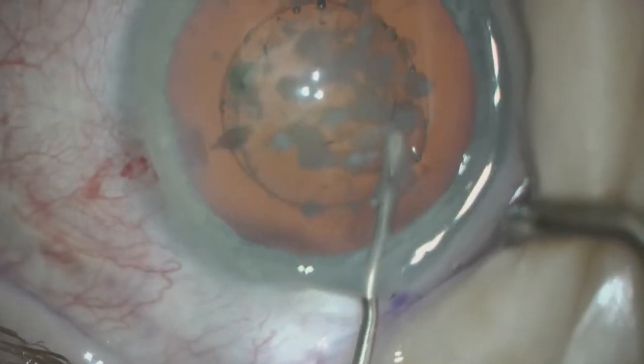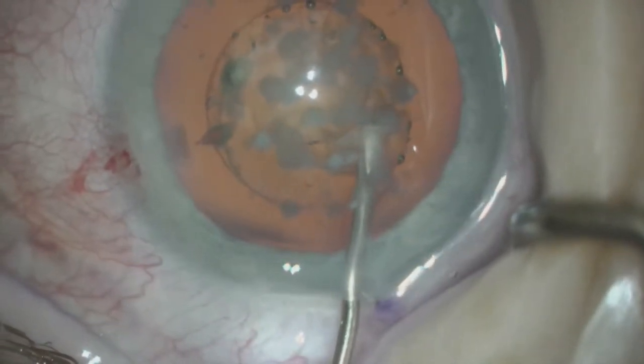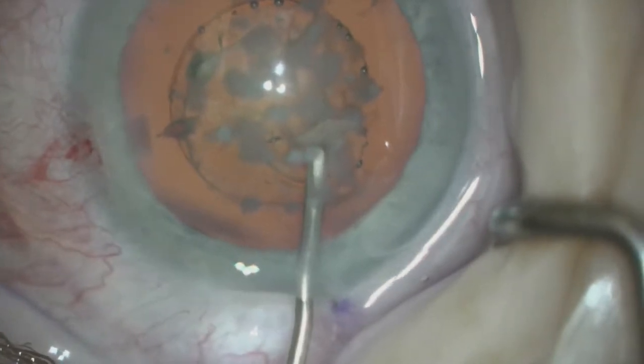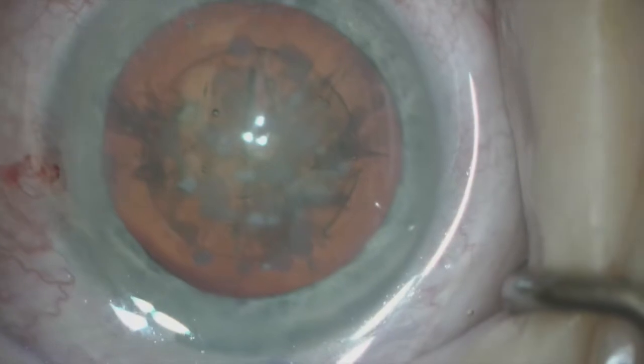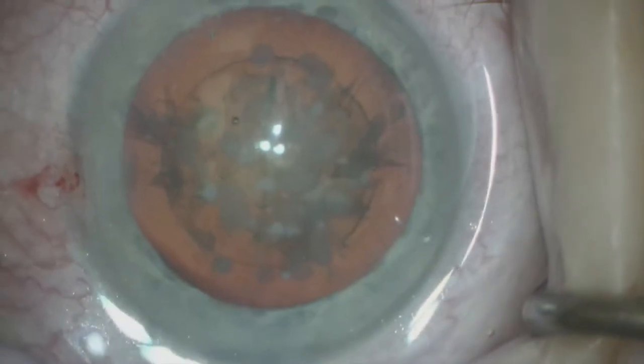One could argue that we could have just done a manual capsulotomy and it would have worked just as well. However, this patient had the same procedure the week prior on the other eye and everything went so well, so we just decided to proceed with LensX capsulotomy on this second eye as well.